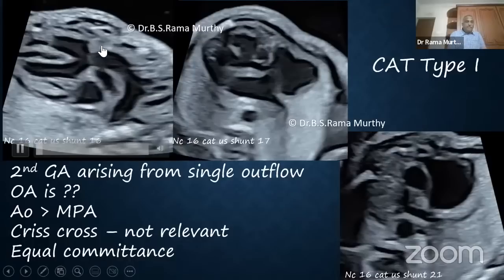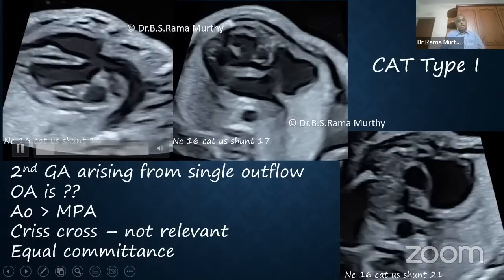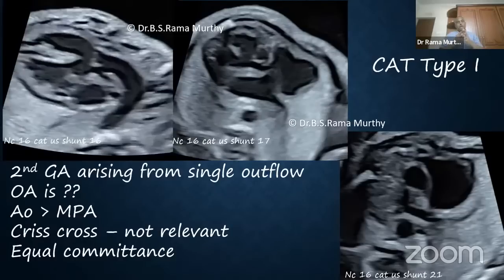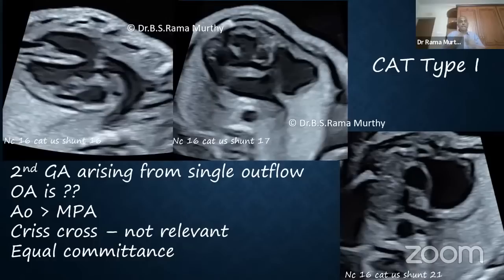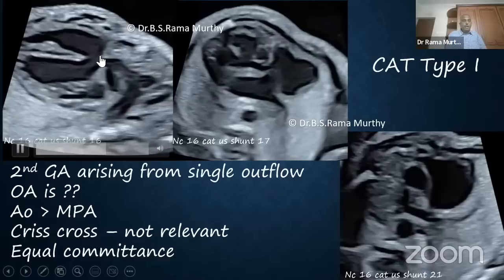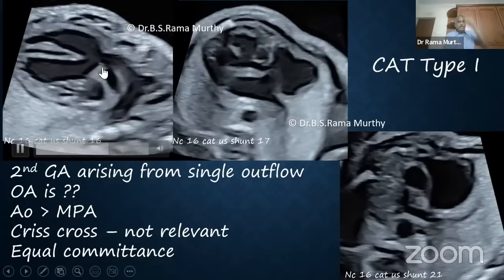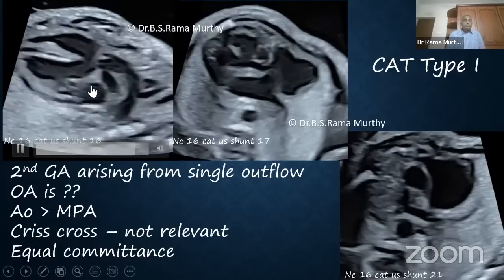The valve, if you notice here, is it normal or abnormal? A semilunar valve, when it closes in diastole, should be very thin and diaphanous, so thin and diaphanous that you see only that central spot where all the three cusps of the semilunar valve are meeting. But here you see that the valve is thick. Why? Because you can see in diastole that the valve is seen throughout as a thick, frayed structure, right?